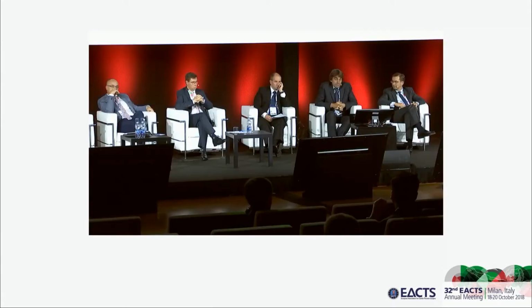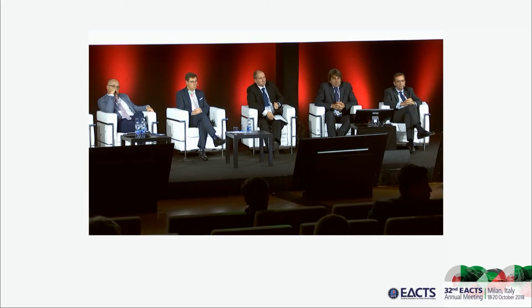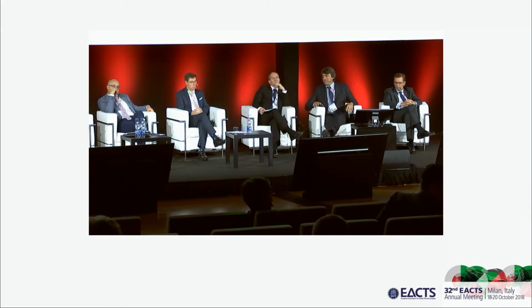I would like you to elaborate a little bit more on external annuloplasty. Actually, there is one weak side of this technique you presented. We all appreciate the idea behind the external annuloplasty, especially since this is how the reimplantation technique works and is a fundamental part of the reimplantation. However, during reimplantation we are just based on some kind of measurements. For example, we are measuring the height of the commissure in terms of choosing the proper prosthesis size for the reimplantation, meaning that we've got a certain size for the annulus stabilization. Now, just having a strip of Dacron, how do you, at the end of the procedure, make sure that you end up with the proper or predicted size of the annulus?